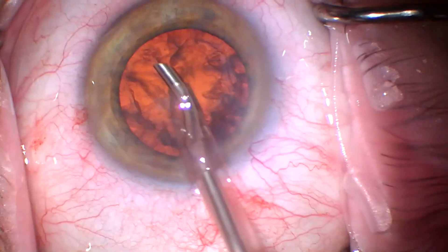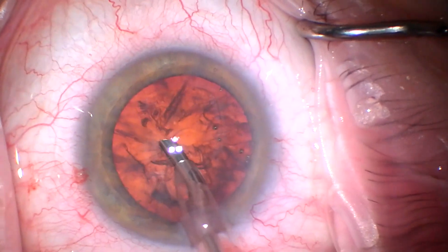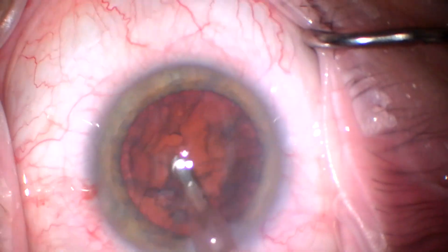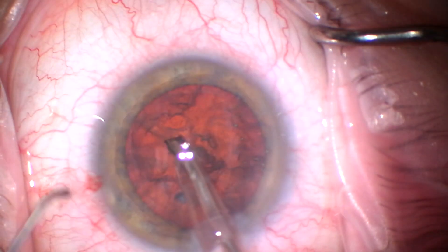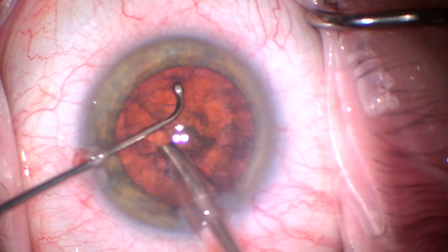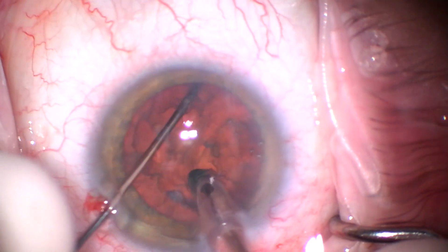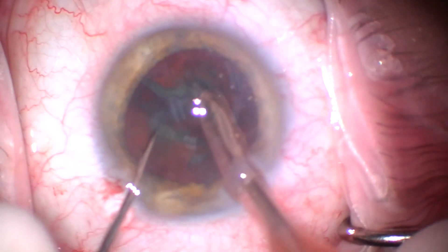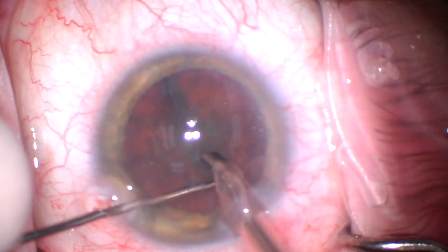I just put a little more viscote in there. Here we'll use the FACO tip to just take a little bit of the epinuclear material off the top, and then once we get down to the nucleus we'll enter with our Cybelle horizontal chopper. This is probably my preferred technique for soft to mediumly dense lenses. Burying the FACO tip in the middle takes about 0.02 CDE on this Alcon Centurion machine.